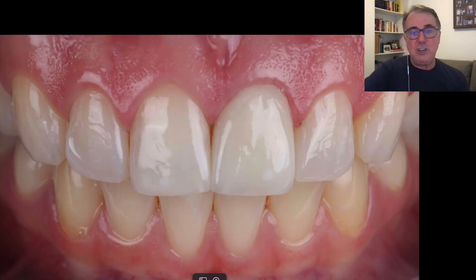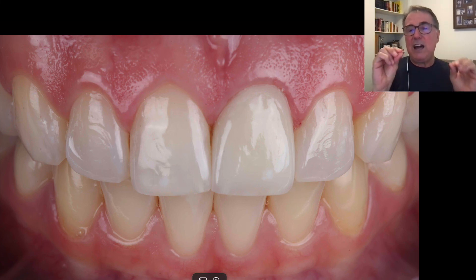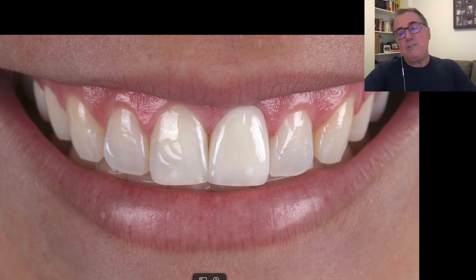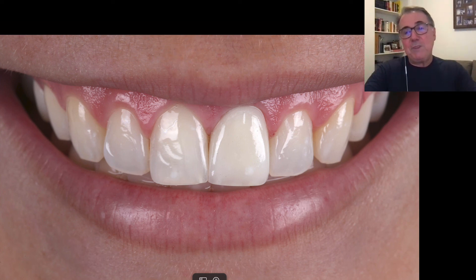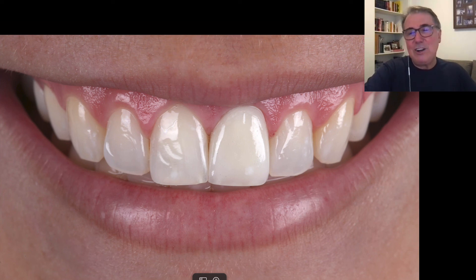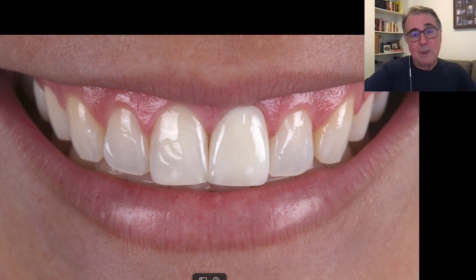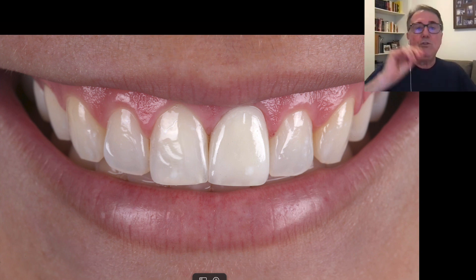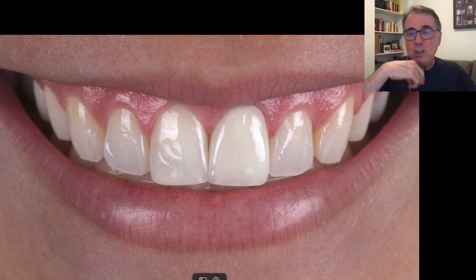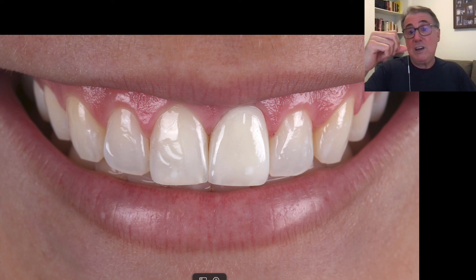This is the result immediately after finishing the cementation. The neighboring teeth are dehydrated and a little lighter — that's normal. And this is the result after a few days — it's pretty nice, I think we got a good result. If there had been a mistake and after removing the rubber dam it looked too bright or too dark, I'd need to start all over again. That's the problem with ceramics versus composites: with composites you can make adjustments, repairs, change the color, change the hue, and add characterizations.